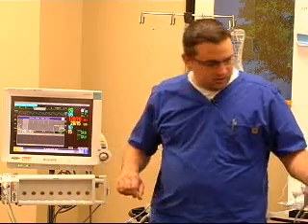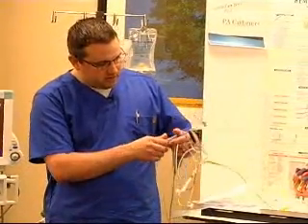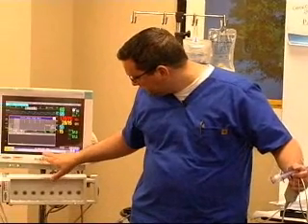All right, so now we're ready to do our first set of numbers. We have all the components here to do that. We have our line set up. We've got our cardiac output syringe connected, our temp connector, computation constant, BSA, all that lovely stuff that's confusing, right? Then we're going to do our first set of numbers.